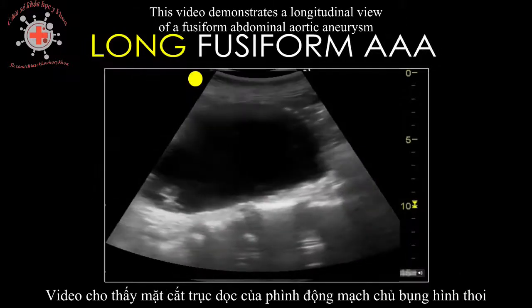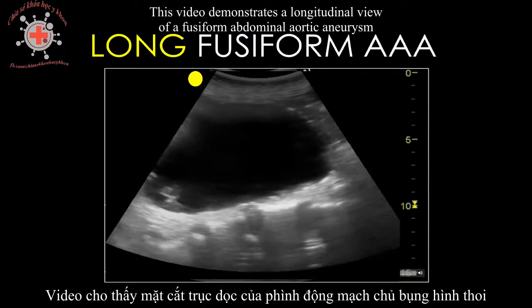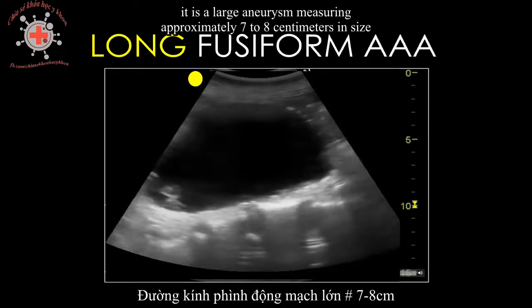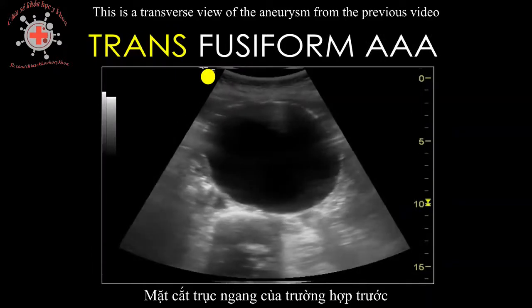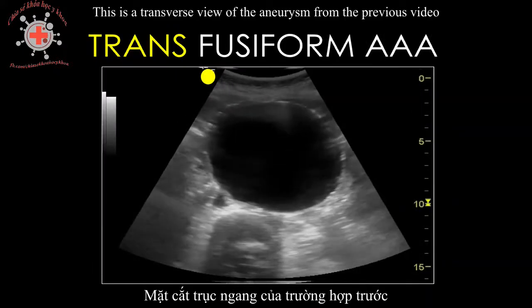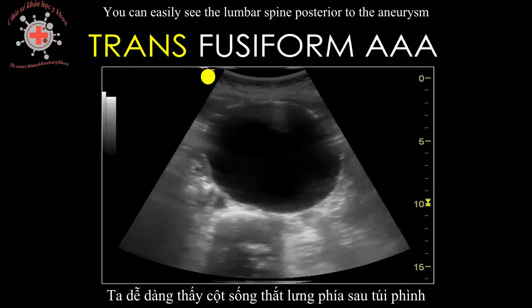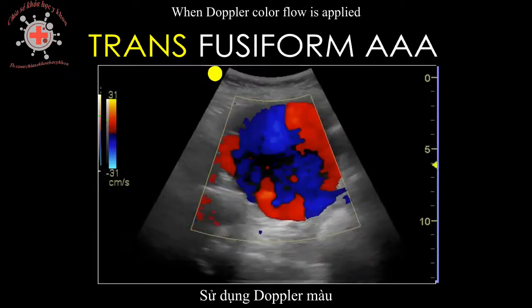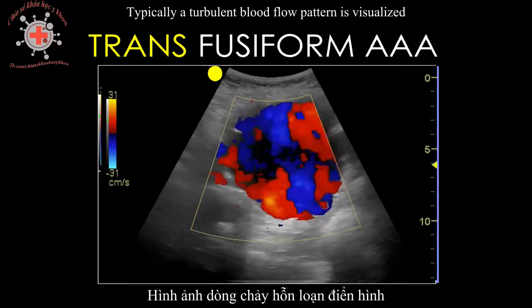This video demonstrates a longitudinal view of a fusiform abdominal aortic aneurysm. It is a large aneurysm measuring approximately 7 to 8 centimeters in size. This is a transverse view of the aneurysm from the previous video. You can easily see the lumbar spine posterior to the aneurysm. When Doppler color flow is applied, typically a turbulent blood flow pattern is visualized.